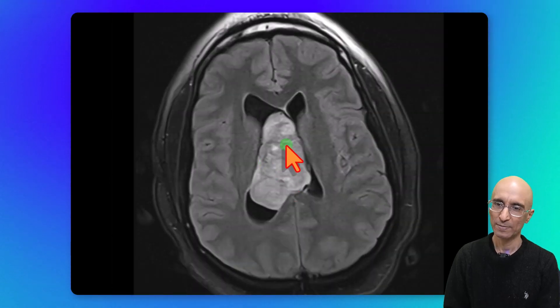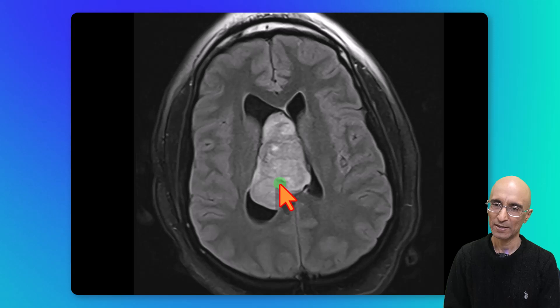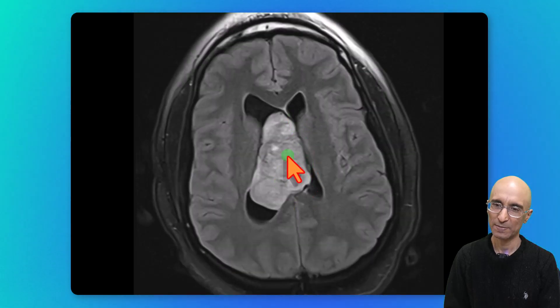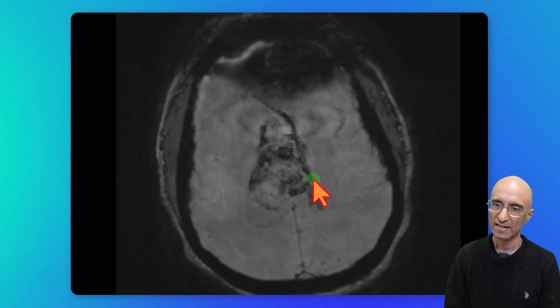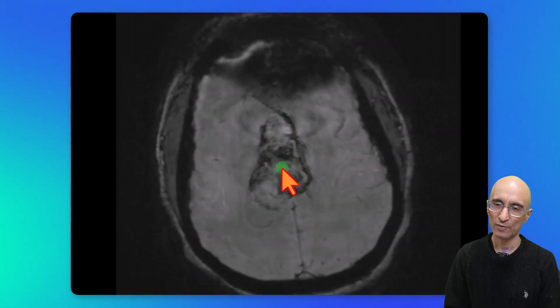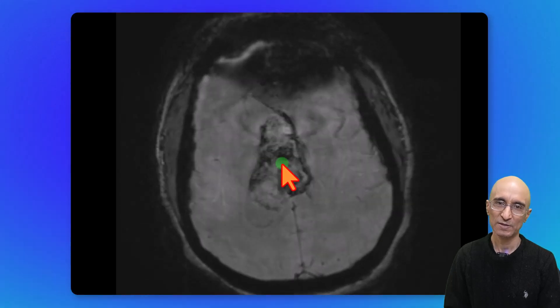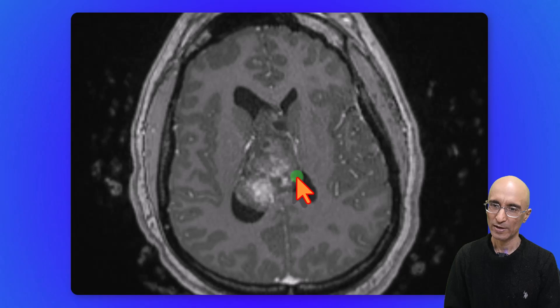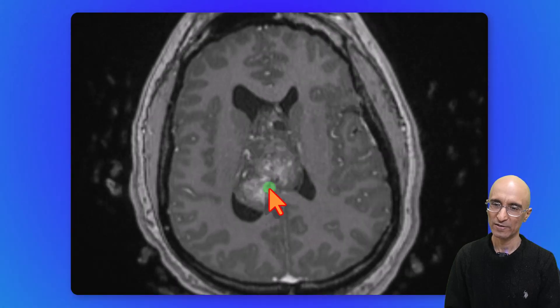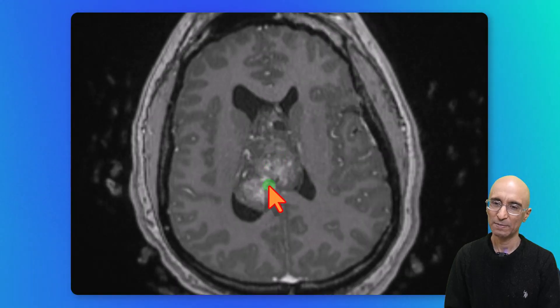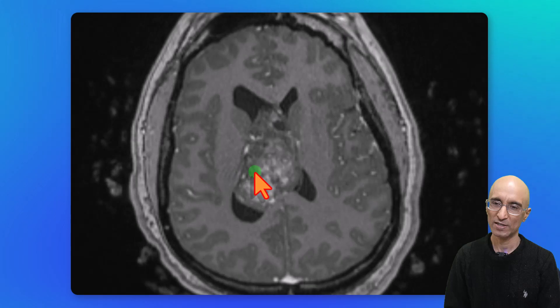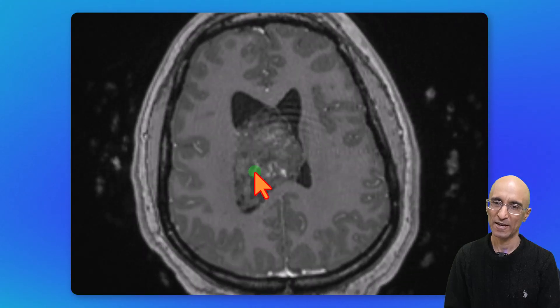On the axial FLAIR images, the lesion is mildly hyperintense compared to gray matter, clearly demonstrating the attachment to the septum pellucidum. On the axial SWI images, we can see multiple foci of signal dropout, likely representing calcifications versus microhemorrhages. Following administration of intravenous contrast, we can see multiple regions of heterogeneous enhancement within the mass.